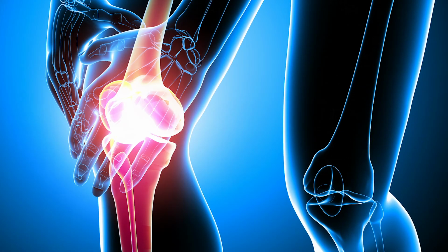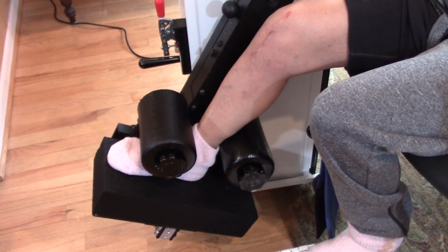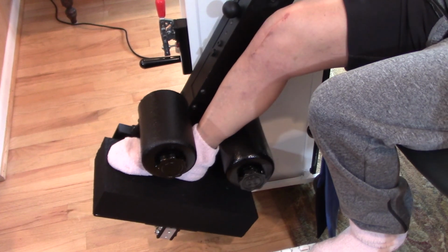The process in the body in which you start to have swelling in a joint creates a situation in which the brain turns off the neurological connection from the brain to the motor end plate units of that muscle. So the more swelling you have, the more atrophy you're going to have because the brain's going to turn off that muscle. You have to re-establish that connection. You do that through the brain. How do you teach that person again to re-establish that muscle to fire, to contract? With the X10, you have that ability. You have the biofeedback mechanism with it. That gives the person the ability to sense and teaches them how much pressure they're using when they're trying to contract their muscle.